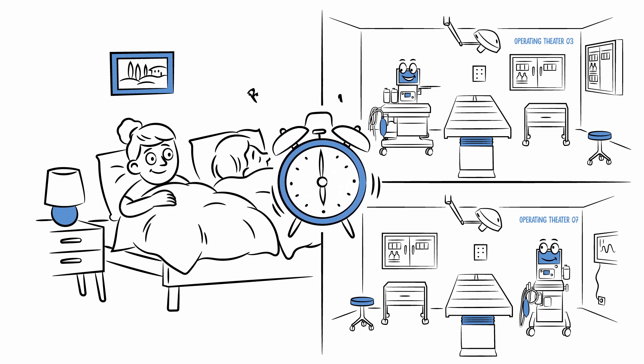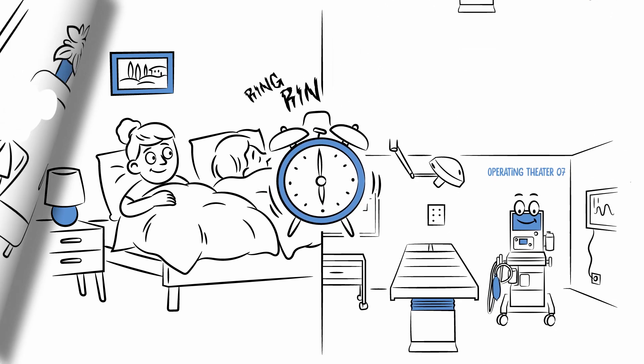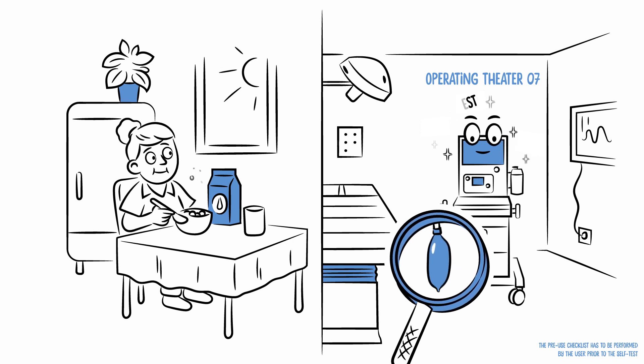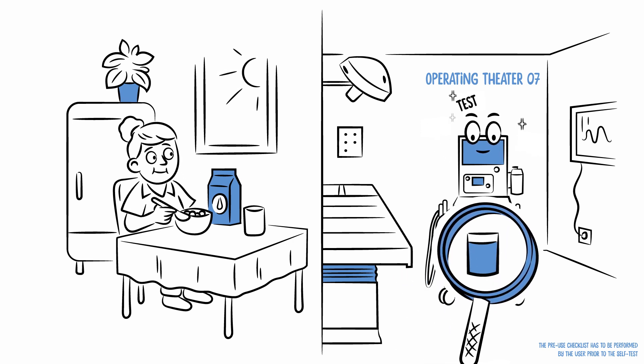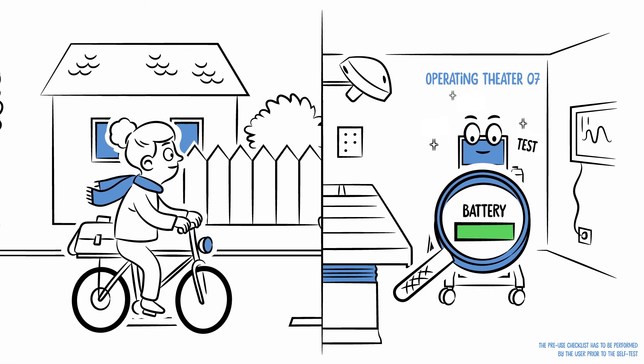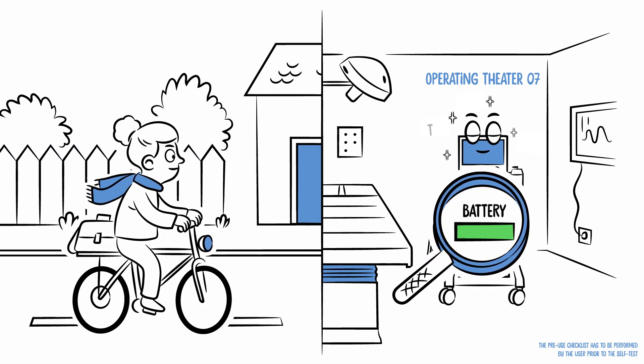The alarm clock goes off. While having breakfast at home, Atlan and Perseus are already performing the fully automated system self-test. Just like the alarm clock at home, with Auto-On, it can be programmed when the Atlan and Perseus should be ready to start.